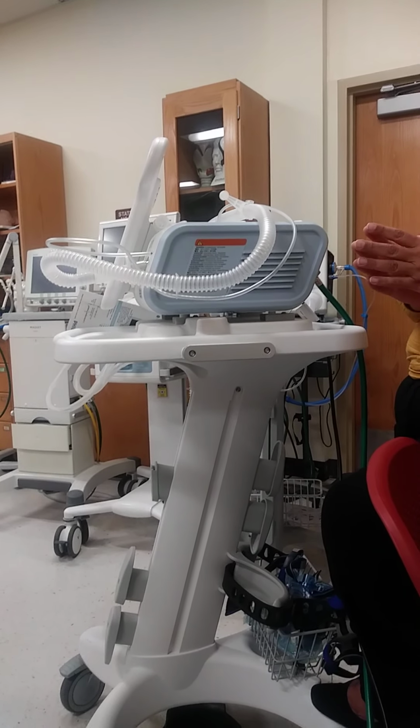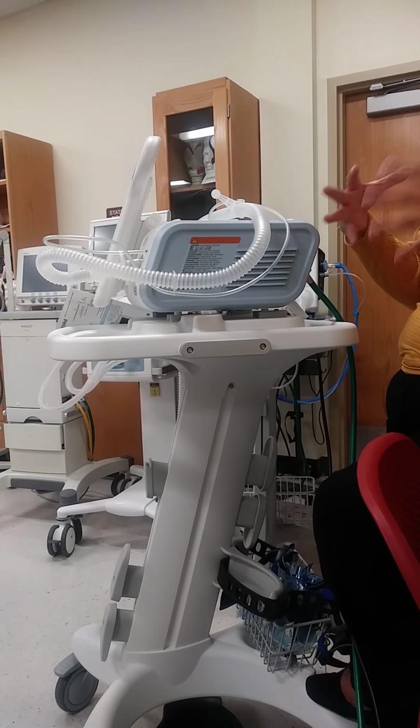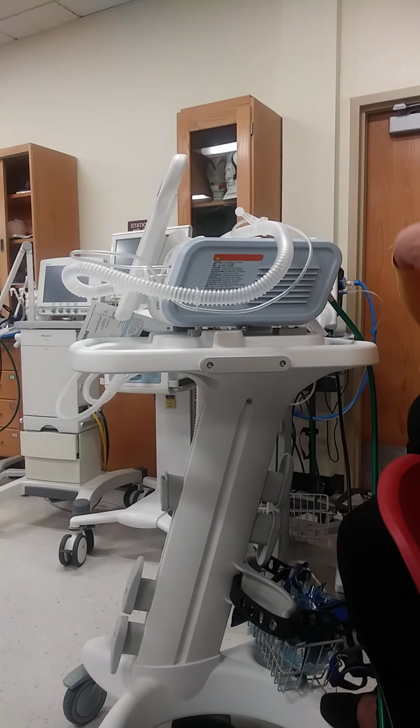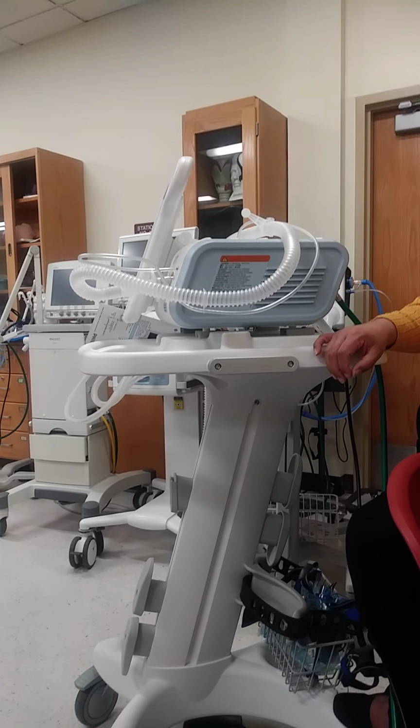So is it just a different mask? Yeah, it's a different mask. Maybe some of the devices are smaller, but it's a similar concept, where your patient should be alert and oriented, and we just use it at nighttime.